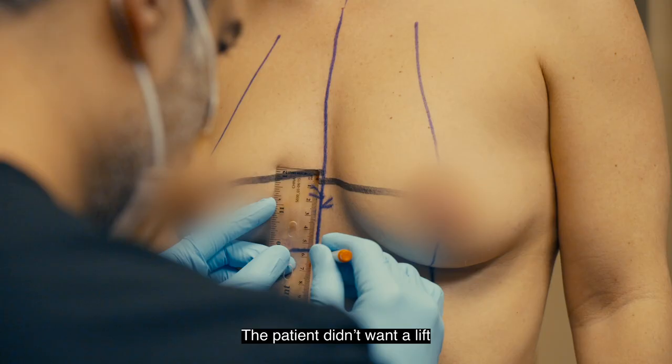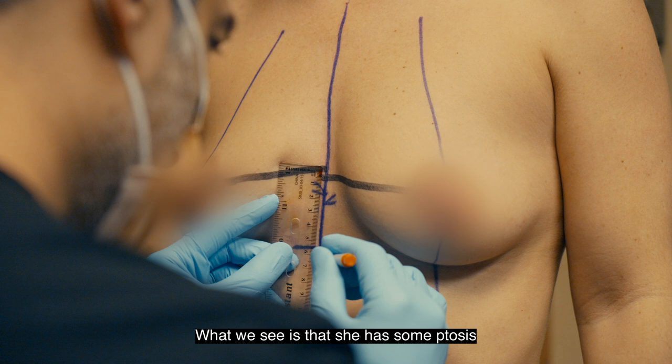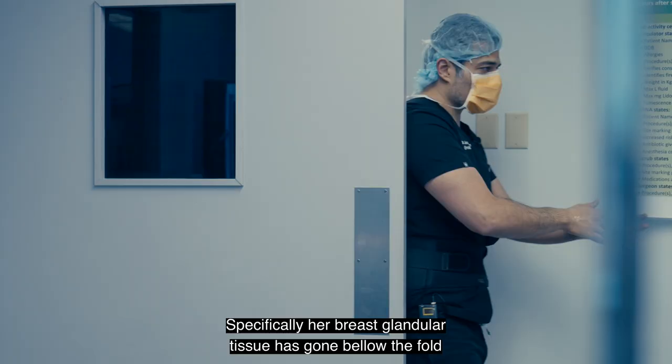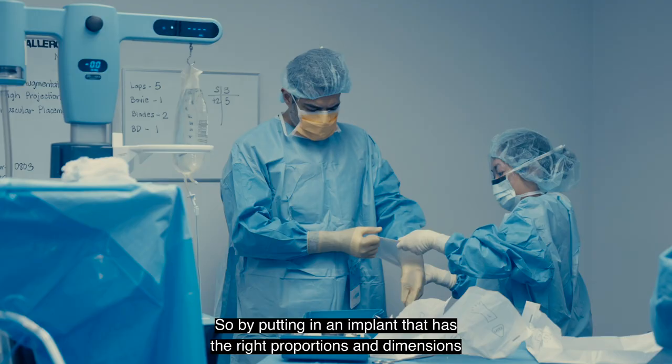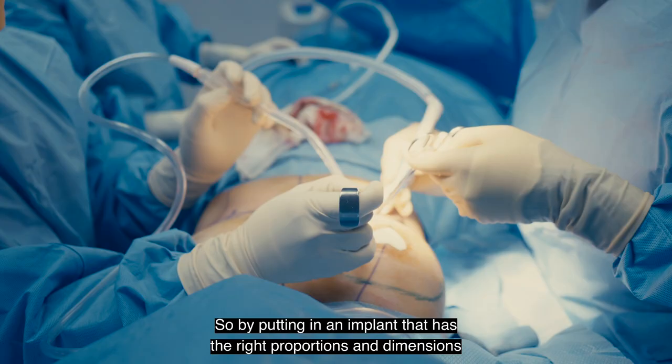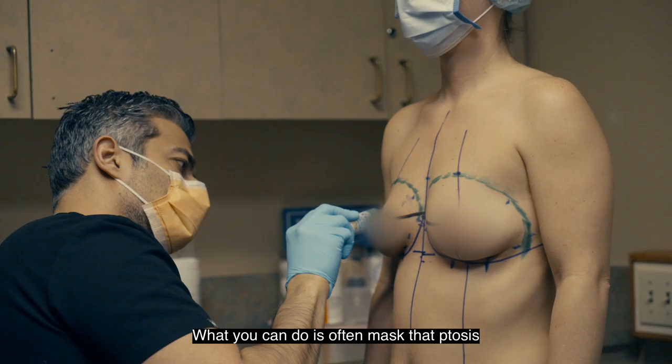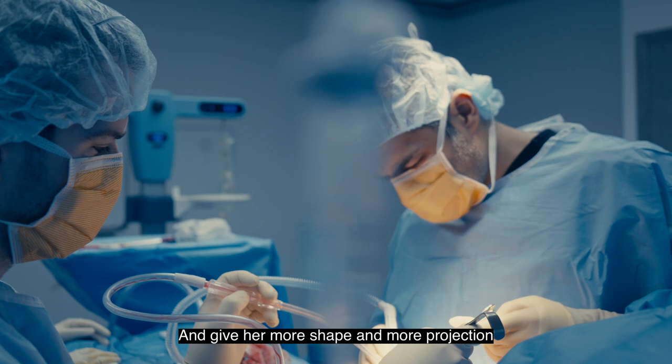The patient didn't want a lift. When you look at her before pictures, we see she has some ptosis, or sagging. Specifically, her breast glandular tissue has gone below the fold. By putting in an implant that has the right proportions, dimensions, and volume she wants, you can often mask that ptosis and give her more shape and more projection.